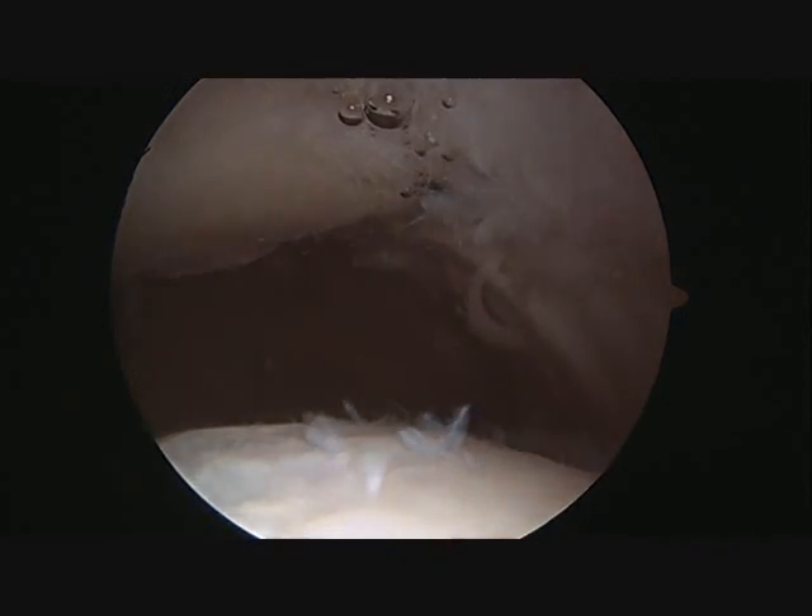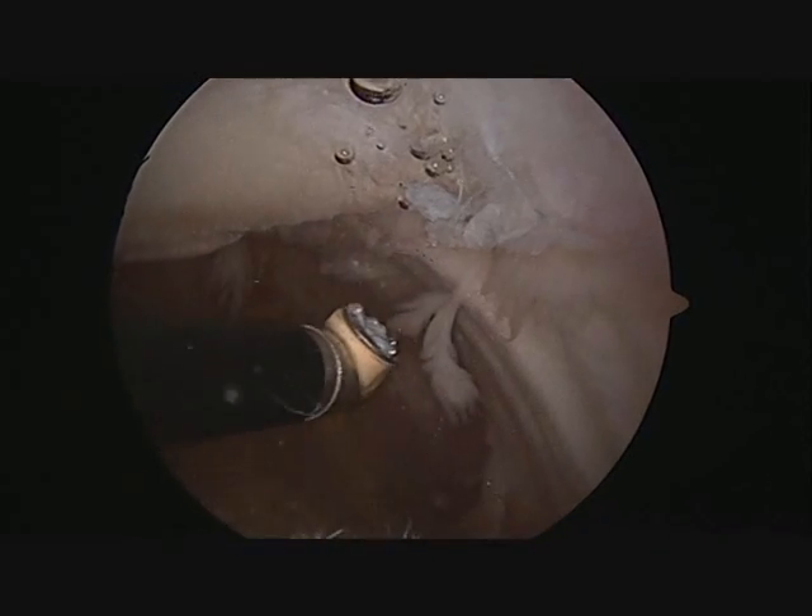Unfortunately, it cannot repair damaged cartilage. In this situation, this type of cartilage damage is the result of lateral patellar compression syndrome, where there is significant roughening of the cartilage on the kneecap as well as on the thigh bone. This is often caused by a tight lateral retinaculum.